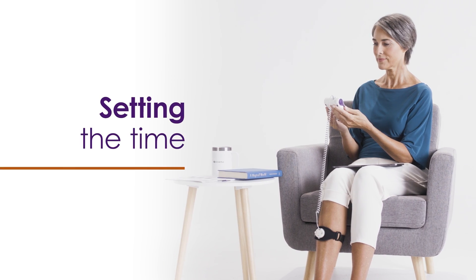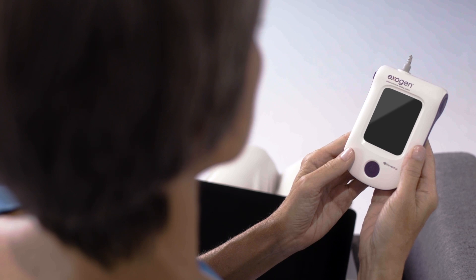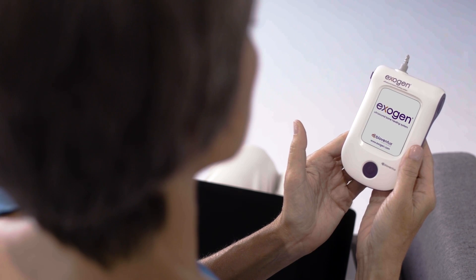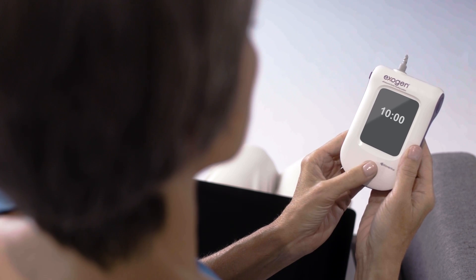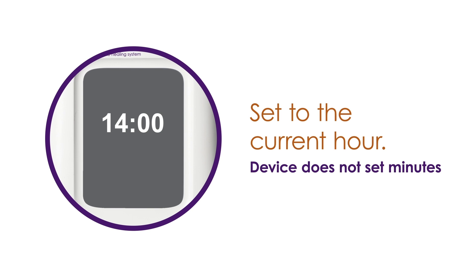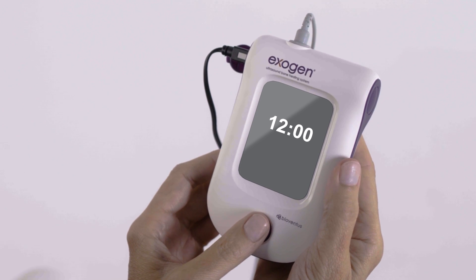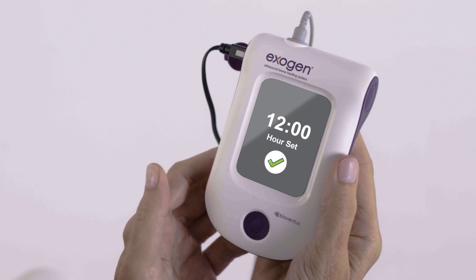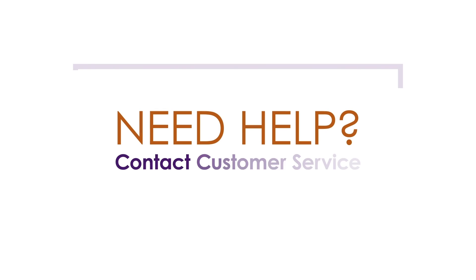The first time you use your device, you'll need to set the time. This will ensure that your treatments are logged accurately. To set the hour, press the button once. The hour displayed may or may not be your current hour. If not, press the button once to advance the time one hour. Continue to advance the hour with separate presses of the button until you are within your current hour. For example, if your current time is between 14:00 and 14:59, set the hour to 14. You do not need to set the minutes. When you have reached the correct hour, press and hold the button until you see the hour confirmation screen. After five seconds, the device will automatically turn off. If you set the time incorrectly or need help, just contact customer service.